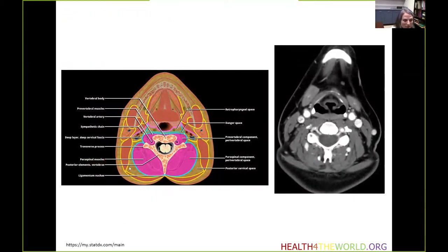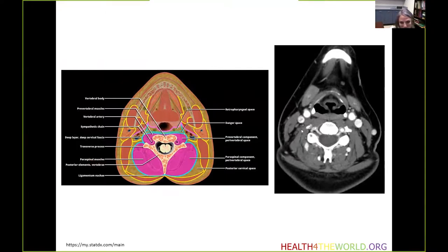This graphic of the perivertebral space shows the prevertebral component anteriorly and the larger perispinal component posteriorly. On the contrast-enhanced CT, we can also see the prevertebral components anteriorly and the perispinal components posteriorly.